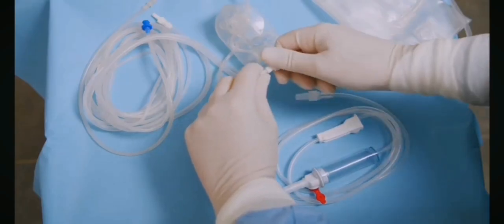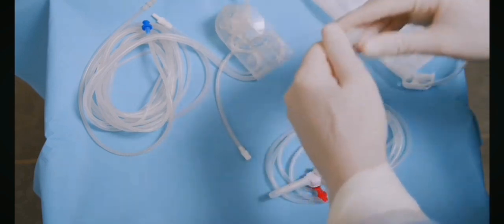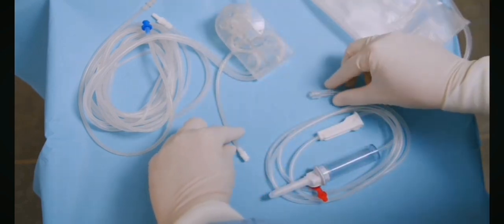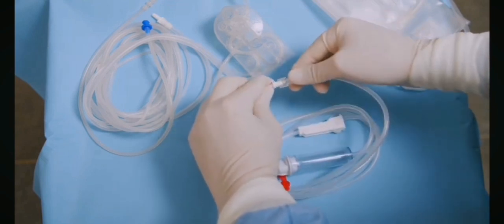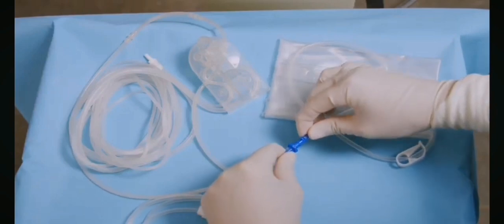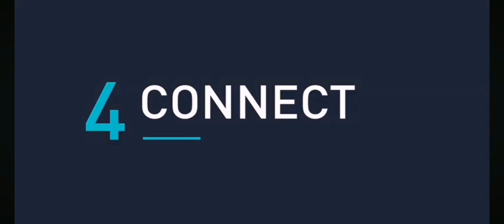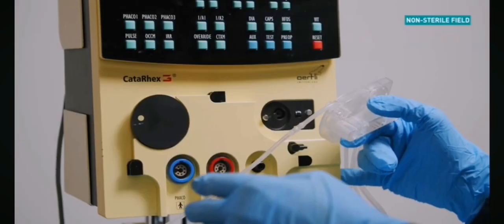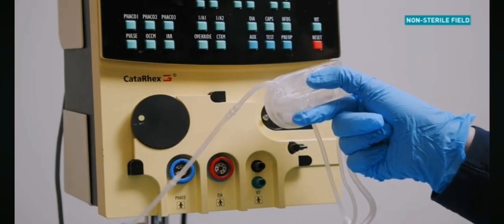First, remove the protection caps from the infusion port and admin set. Connect the admin set to the infusion port of the Cataracts cassette. Secure the drainage tube from the cassette to the drainage bag or bottle.